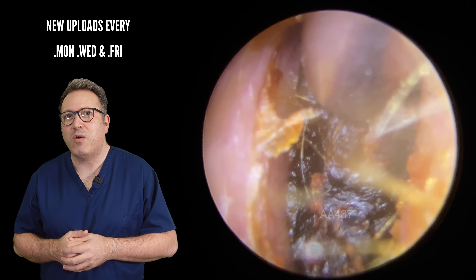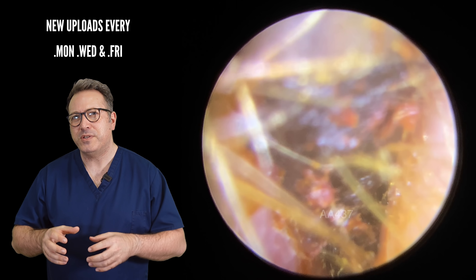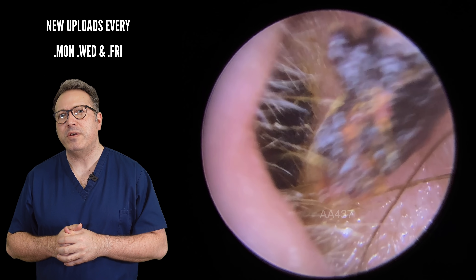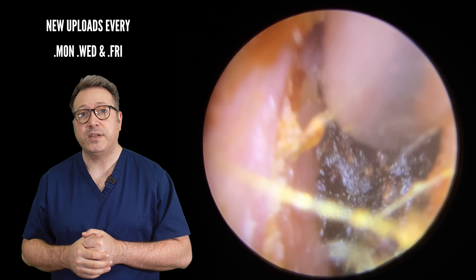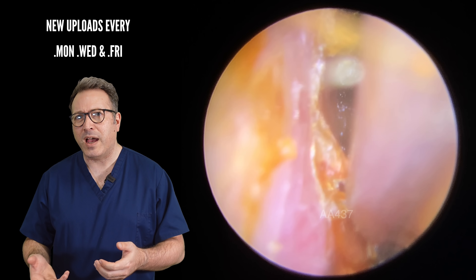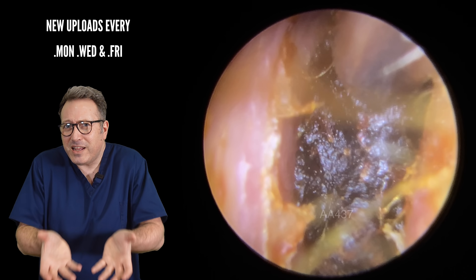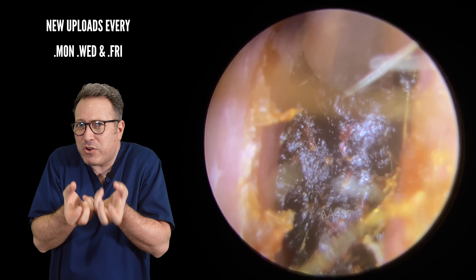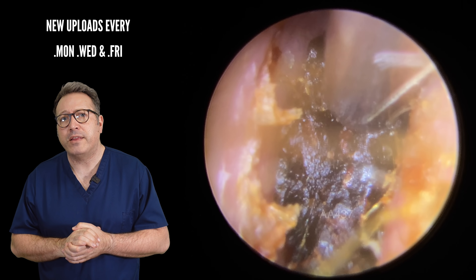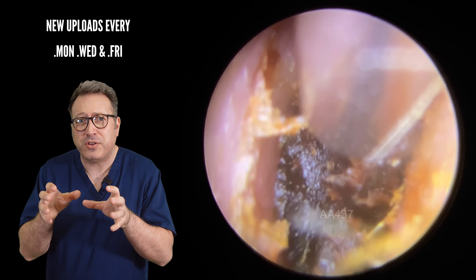So we have to change tack, work on a different position and try to roll this forward. You can see very dark, quite dry material at that section. When we take that away, there's still more behind it. Now we've taken out the top section, I'm trying again to lift the bottom because that's going to be anchoring this into place — it's very stuck to the canal wall. So I'm probing this wax looking for any weakness, anywhere we can get a little bit of purchase on it.